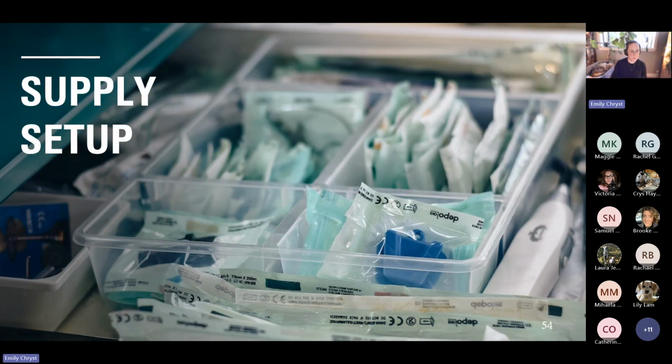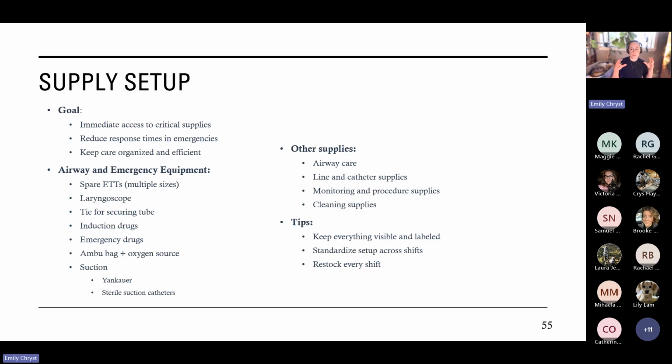First, let's talk about supply setup. Now, we need to make sure that if something happens, we don't have to go looking for anything, and that everything that we need to take care of the patient is within arm's reach. Now, we will have setups for airway and emergency equipment, and then we're going to have setups for all of the other things we're doing. But airway and emergency equipment is going to be the most important.